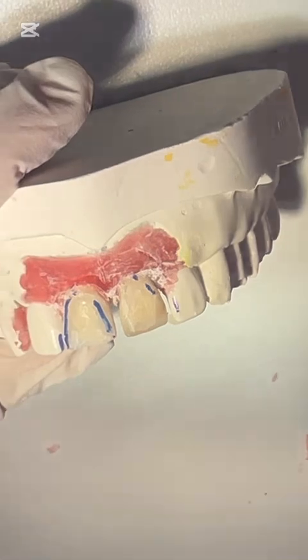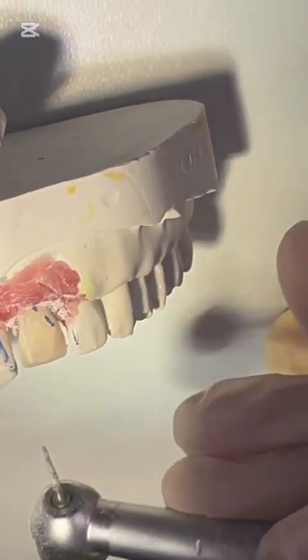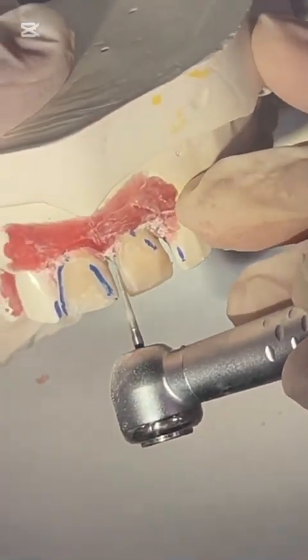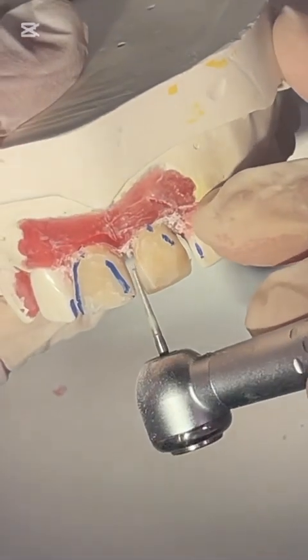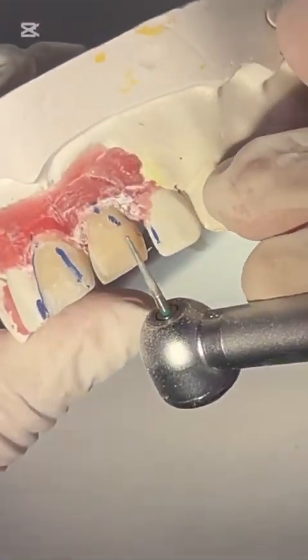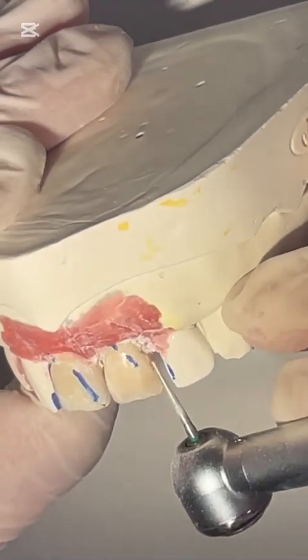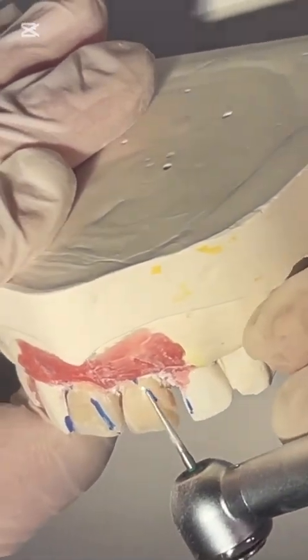Usually how we do beveling? With needle form burr. It could be green, blue, whatever you have. All the approximal surface, a little bit the incisal because I will add there, the distal surface.